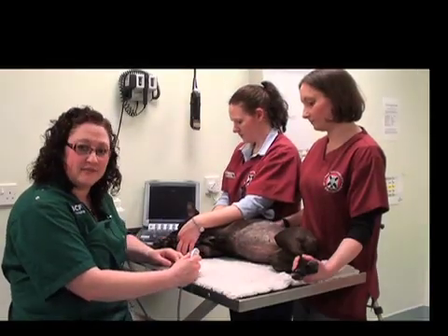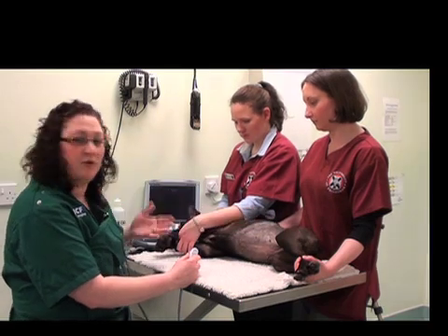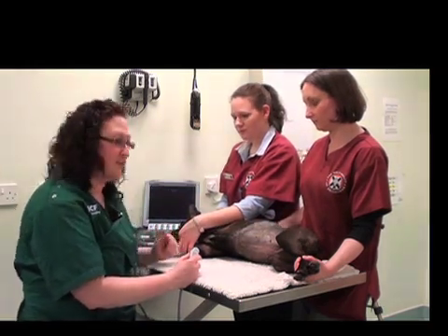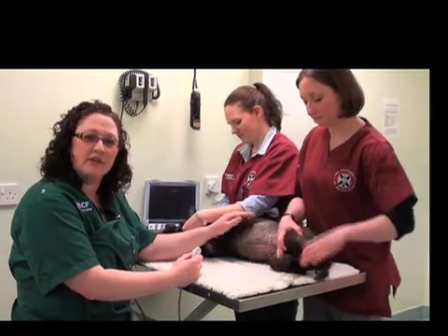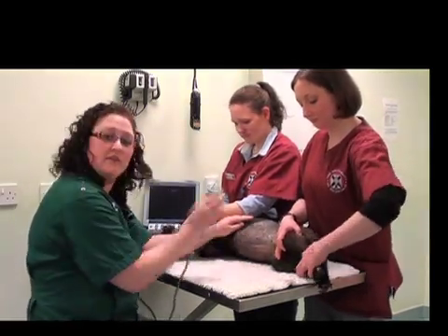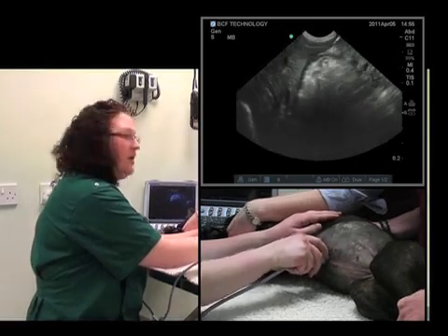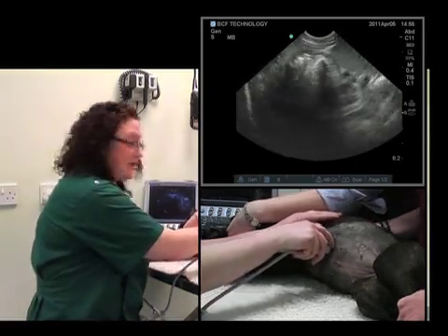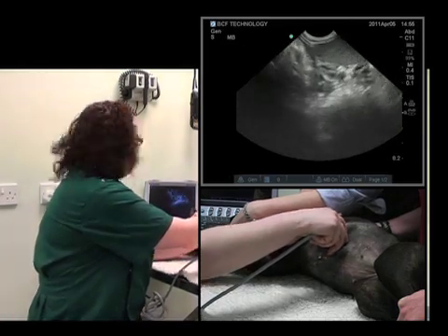Now we'll proceed on to the spleen. The way we'll do this is we'll start off by finding an organ that we know, which we've just found the liver, so that's a good place to start. We'll start at the level of the xiphisternum in the sagittal plane, and slide along the level of the ribs, and the spleen starts to come into view.